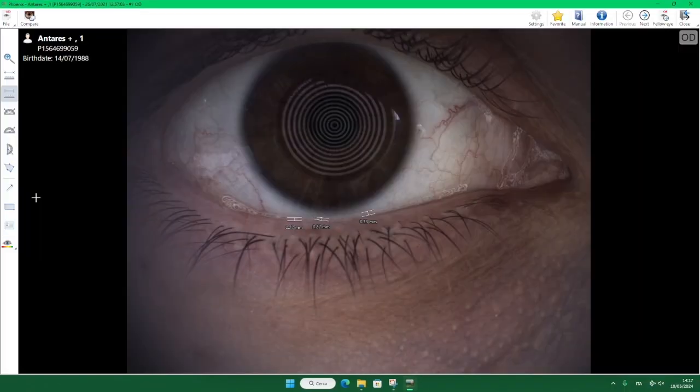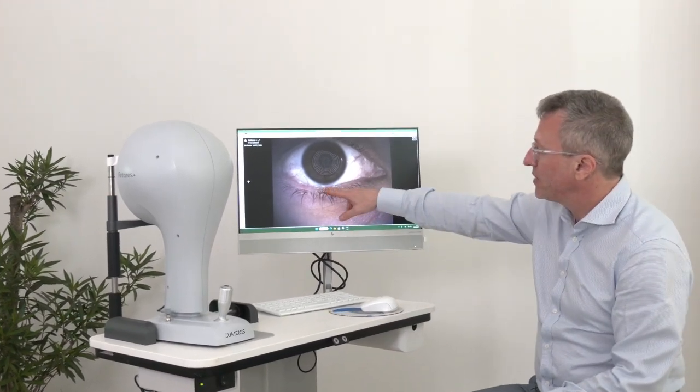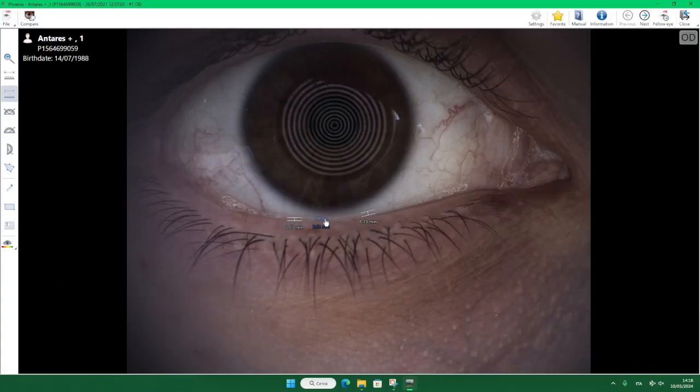Usually it's possible to do that by measuring the tear meniscus height. When the tear meniscus height is below 0.2 or 0.15 millimeters, usually you can have a dry eye condition, so you can measure these parts at several points, and this can give you information about the volume.